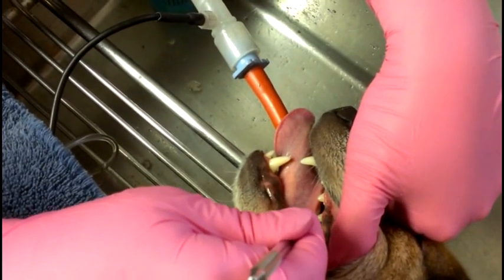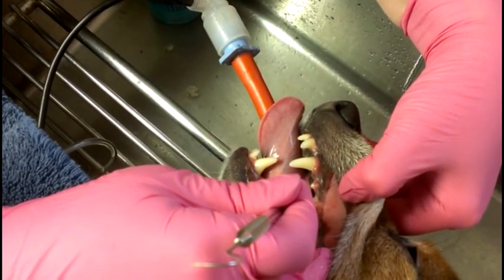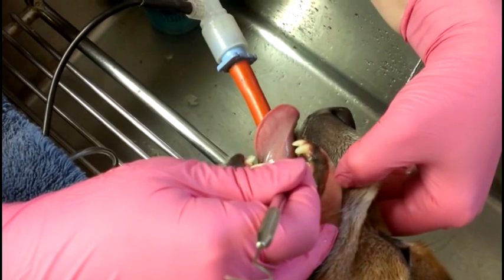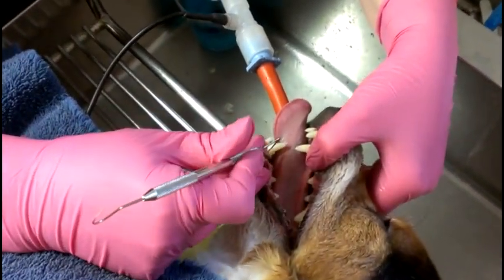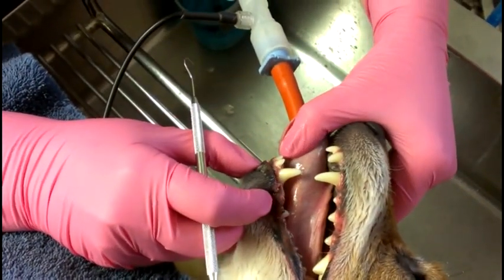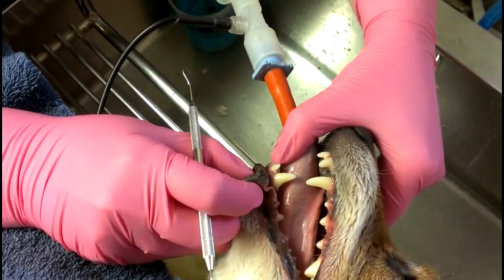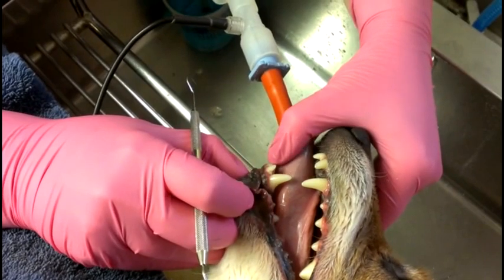But everything else seems to be nice and clean, no fractures, not a lot of pocketing around the gingiva. So that's basically all I'm looking for, any loose teeth. It's pretty common for them to have loose incisors as they get older. They just kind of lose the bone that holds that tooth in there, but hers seems to be pretty stable.